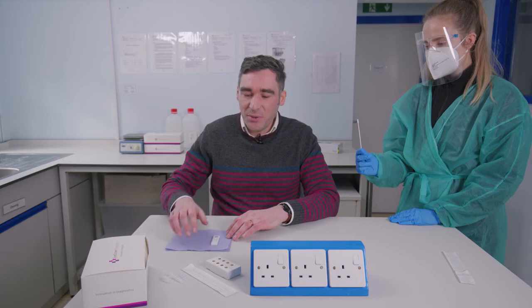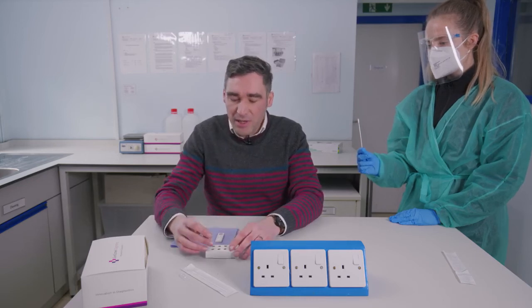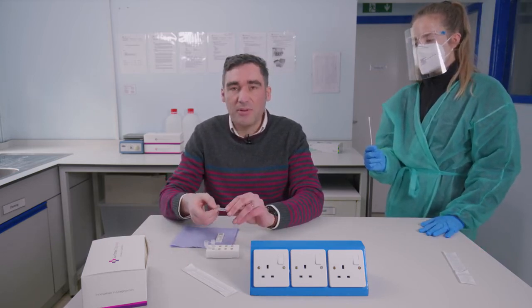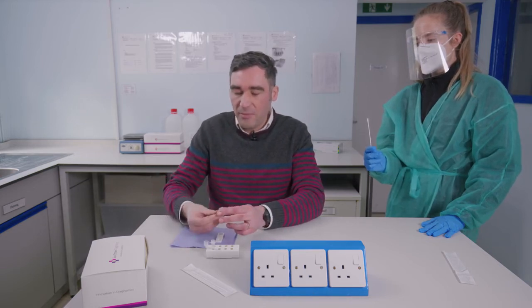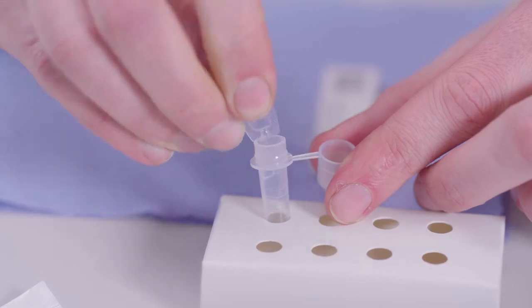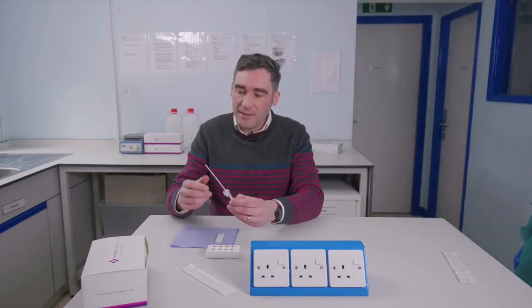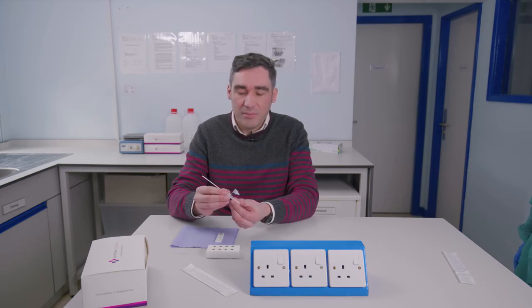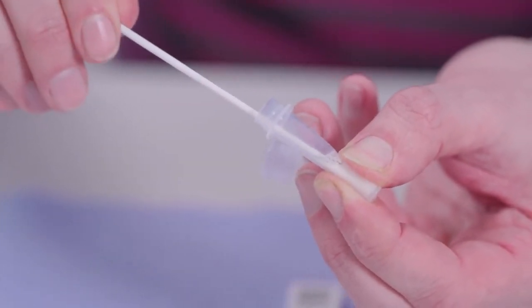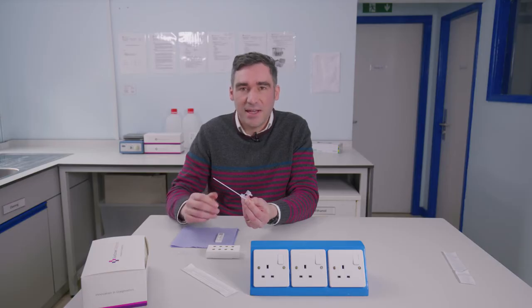Now we need to prepare the buffer solution. We have a vial here which we use to mix the buffer and the swab together. We twist off the top of the little vial like so and then add the buffer into the vial. Pop the swab in there and then pinch the flexible part of the vial. By turning that we're transferring the sample into the buffer, which helps break it down so it can flow through the test and the test can detect any antigen present.